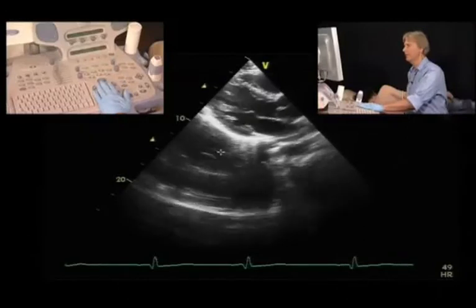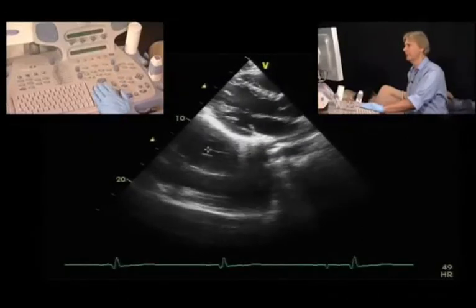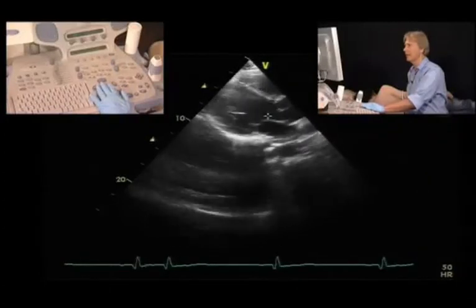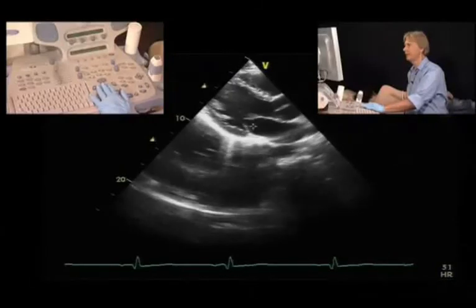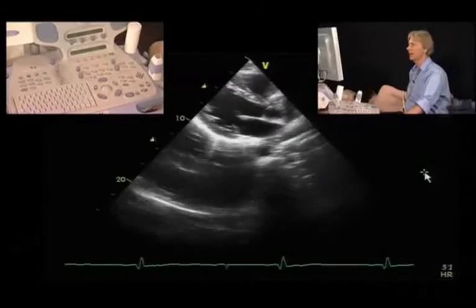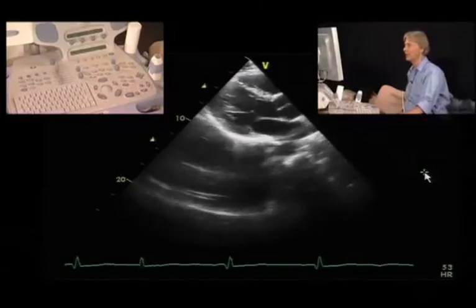And reverberation is one of the causes for the so-called mirror artifacts. A type of artifact you will commonly encounter in patients who have quite good image quality and very strongly reflective surfaces. This is an example of a mirror artifact. So focus your attention to this part of the image here. So you see structures here which move but which are clearly outside the heart, and they resemble the mitral valve. So this is just a mirror of the mitral valve. Obviously this can't be another valve. It's highly unlikely that our patient here has a valve within the stomach somewhere. So an example of a mirror artifact.